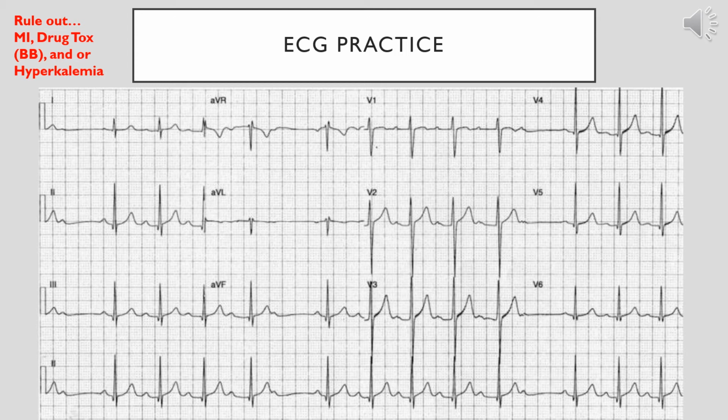Looking further at the EKG, we want to evaluate whether there are any changes with T-wave flattening or inverting that we wouldn't expect to see. The T-waves all look pretty consistent throughout. For the ST segment, we don't see a big ST elevation. We do see a pretty good isoelectric line throughout. Any pathological Q waves? Nope, no pathological Q waves. So a normal sinus rhythm with second degree AV block Mobitz 1 would be a good way to characterize this EKG.